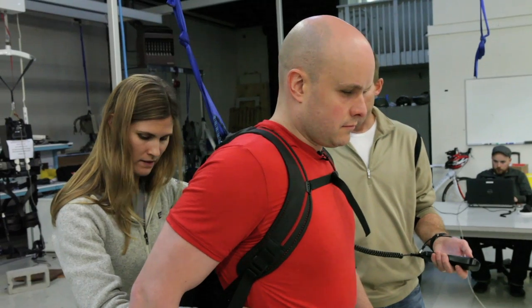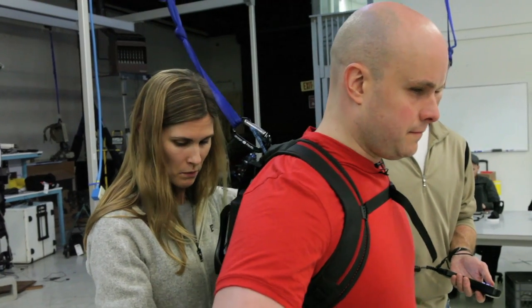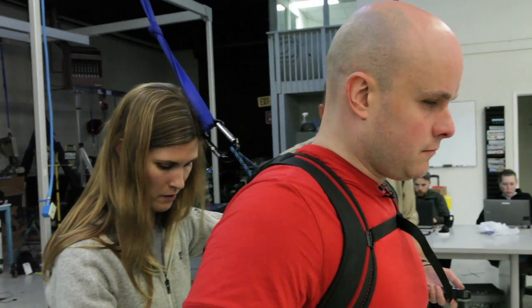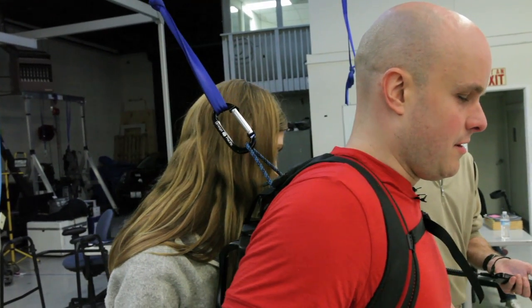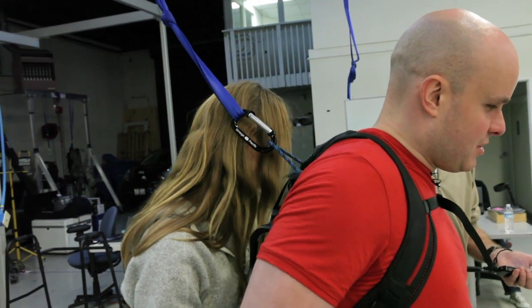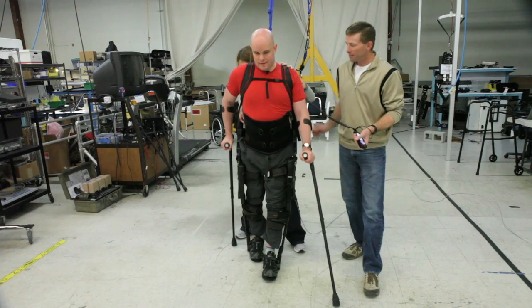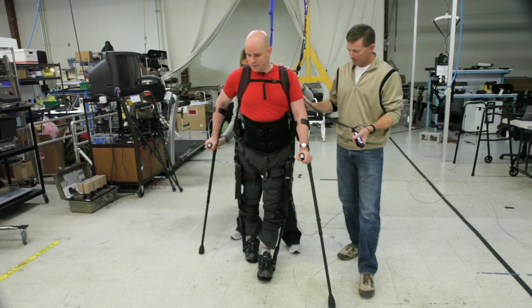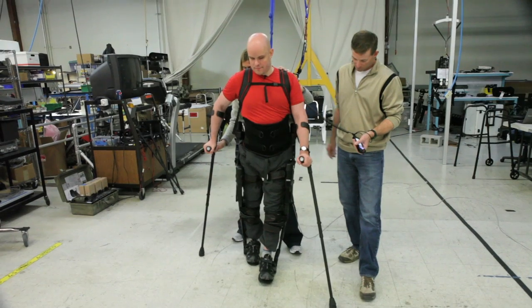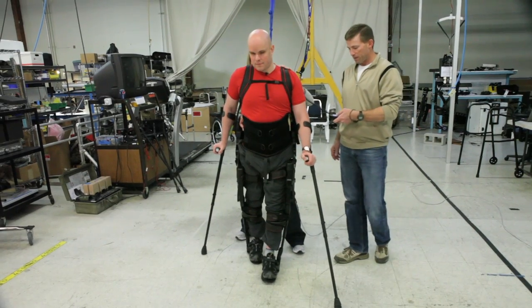Now come forward to here and I'm going to step now. Short and wide on that crutch. Push to it. Step. Push to the left. So I'm going way too far forward with my right crutch — get the crutch back out to your side. You moved in so close. We're going to push left and forward.